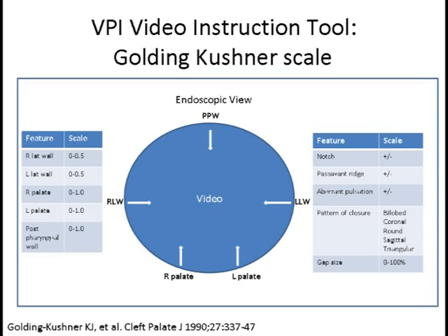Conversely, posterior pharyngeal wall movement from rest to contact with a non-mobile palate would be rated as 1.0. Other descriptive features of the Golding-Kushner Scale include notation of the presence or absence of a notch on the dorsal surface of the muscular palate, a Passavant ridge, and aberrant carotid pulsation.